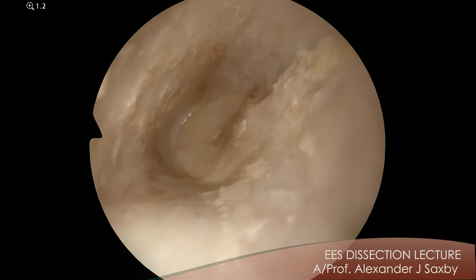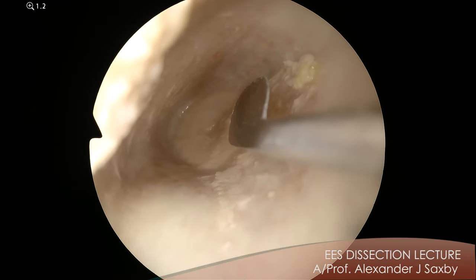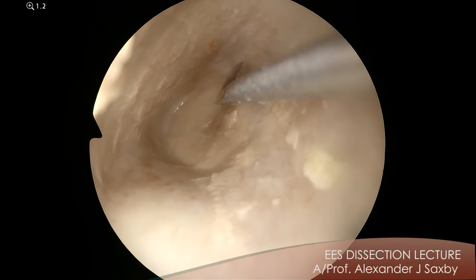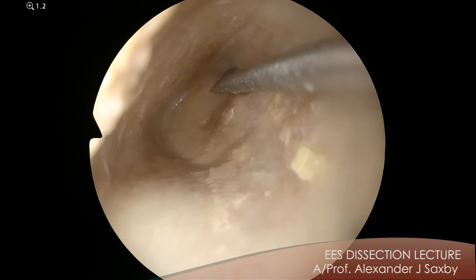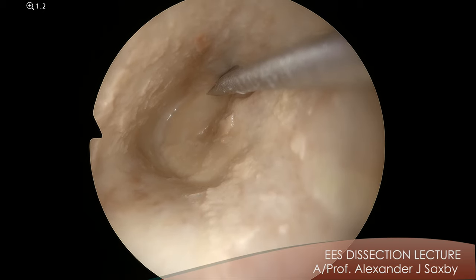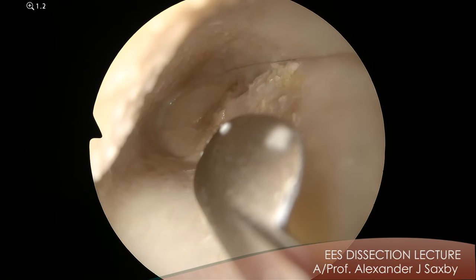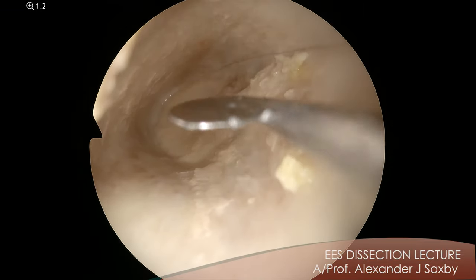My advice when you're making your incisions is to use a straight knife. Here I have a D knife or a plester knife, but equally you could use a sickle knife, but my biggest advice would be to use a beaver blade. A beaver blade is a single-use instrument, but it's very, very sharp. So when you're choosing your incisions, tailor it to your operation. In this case, I'm going to make the cut at about 11 o'clock and about 6 o'clock. Always start medial and then come lateral. Press very hard with the blade and cut once. I'm pressing hard and going slow. Make your incision firm and definite. Not sawing back and forth — we want a single, precise cut because then the edges will come together at the end of the operation.